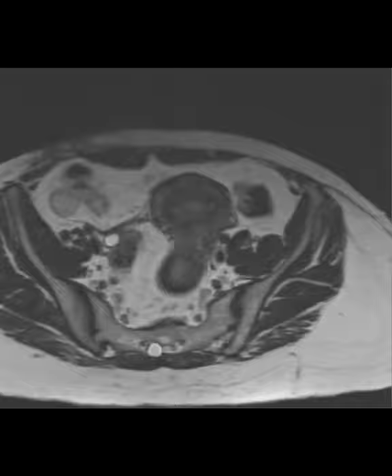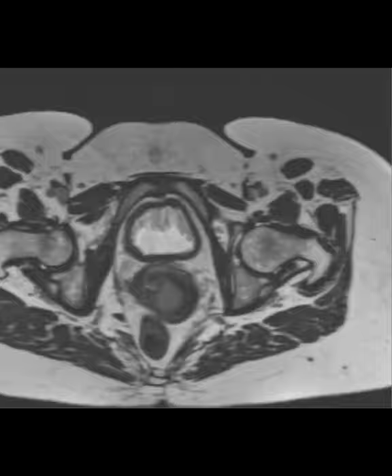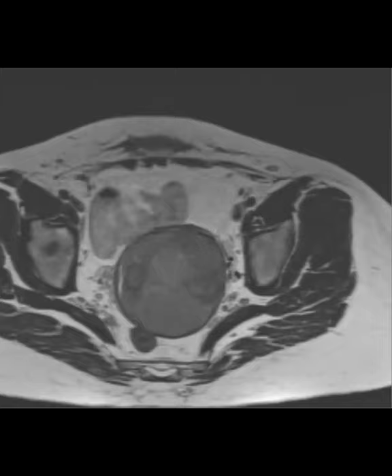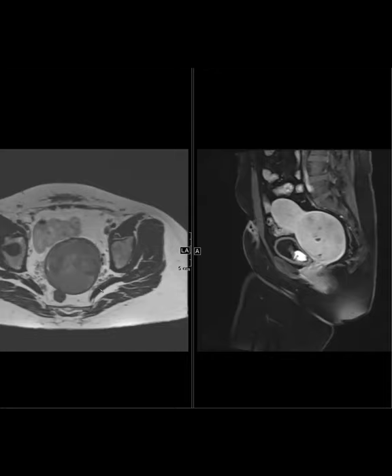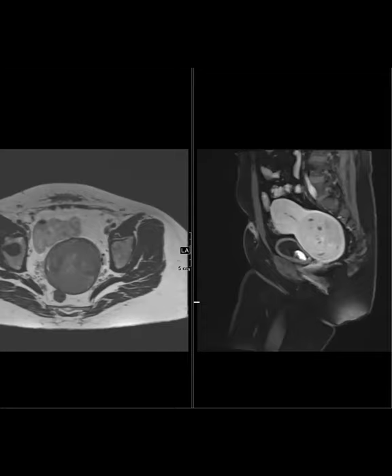But this just happened to turn out to be a leiomyosarcoma of the cervix. Wow. I don't know how we would be able to clinch that, but I just want to contrast that it does look quite different than that other kind of cervical cancer, that it doesn't really have that evil gray infiltrative appearance. It's kind of more of a round, pretty avidly enhancing mass. Do you have the DWI?